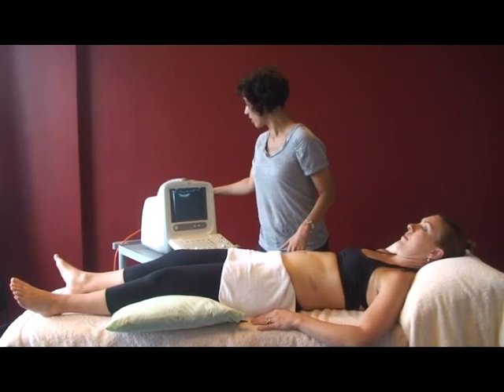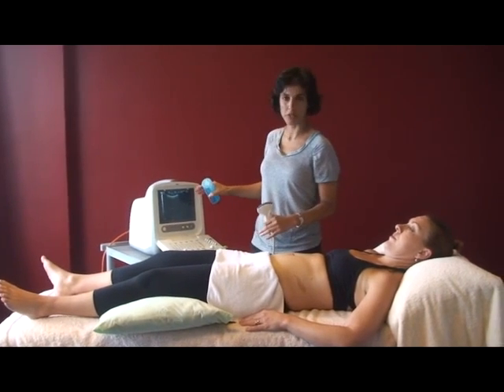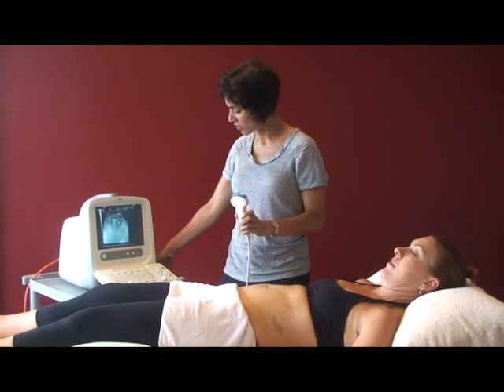Next, we're going to go to the ultrasound machine. We'll use the frequency setting between 2 and 2.5 MHz, and apply lots of gel on the curved transducer head.